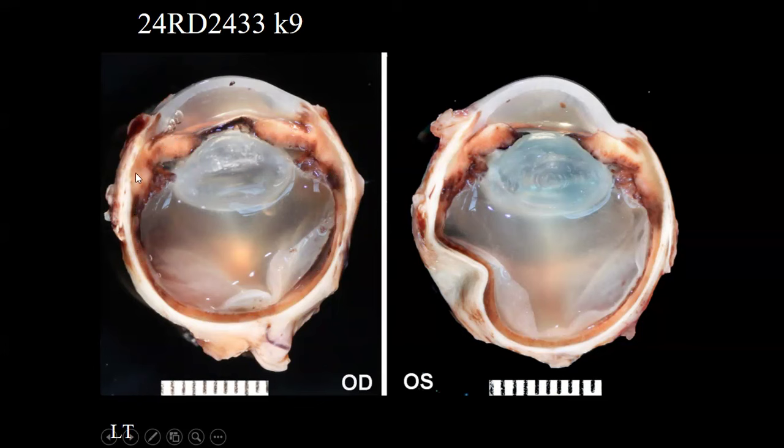It's a mixed breed dog. So let's see, they said the eye color was brown. Believe that, but there's also this white tan infiltrate all throughout the uvea in both eyes, right? Another important thing to observe is how the chambers are relatively clean and quiet, and there is bilateral retinal detachment also. So I can choose, let's see, let's start. It doesn't matter, to be honest, because they are identical, as it is usually the case.